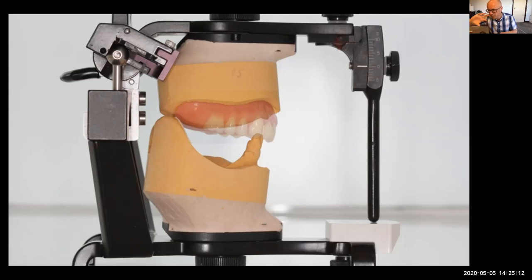But as a separate point, Stuart, just think about it. If you are going to have implants going in at the back, and then you've got a locator abutment on top of that, and then metalwork inside the denture, we are often stymied for space. And if there's a bar there, a fixed beam, hybrid denture, then we would definitely have to drop the whole of the occlusal table for the upper for Anne here, and her aesthetics would be ruined, or just wouldn't be as good at all. And I see it all the time, when I'm watching really beautiful high-end aesthetic work shown with all on 6, the end aesthetics of the actual smile just doesn't look right because of a lack of interarch space.